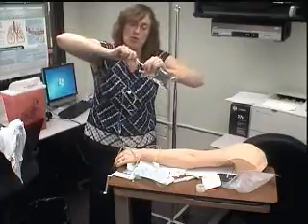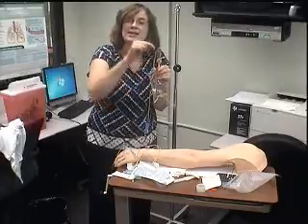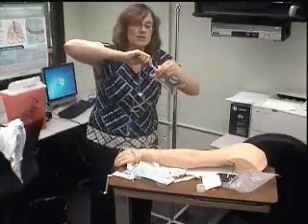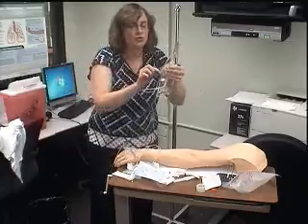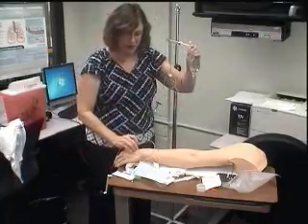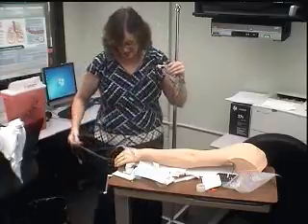Now you want to put it up all the way, because anything that's exposed will have germs on it. So the next time when you switch the bag out, you don't want to have germs being put in. So you're going to put it in as far as it can go while keeping it straight so that you don't poke through this. If you poke through this in any way, it becomes contaminated. It's not good anymore. Also not good anymore if you have this dropping all over the floor. If it touches the floor, it's not good.